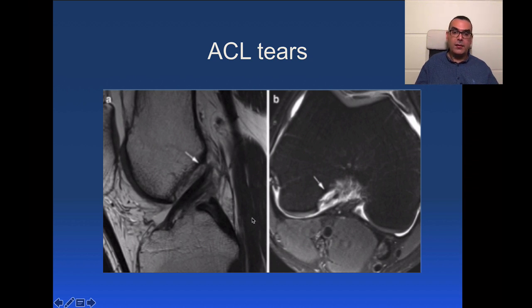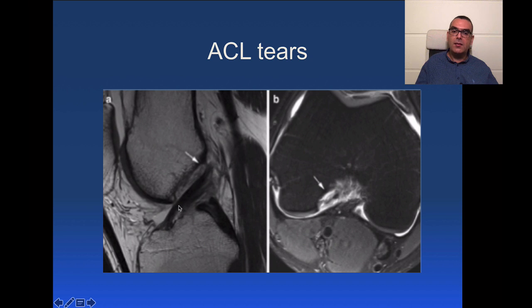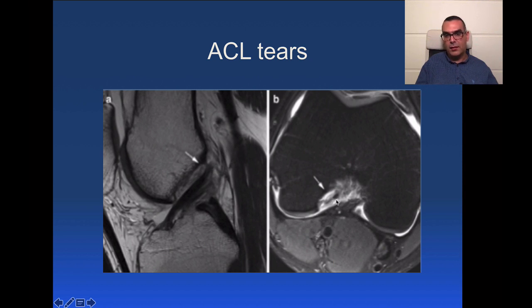Regarding ACL tears: axial images are of extreme importance. On a sagittal proton density without fat suppression, the ACL may appear in normal course with relatively homogeneous hypointense signal, but the femoral attachment may not be clearly identified. When you see the axial image, there is clearly a complete tear of the ACL femoral attachment — the normal hypointensity is absent, replaced by fluid signal, ill-definition, and surrounding edema.